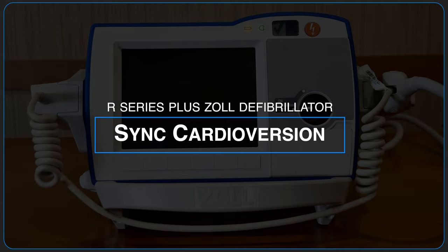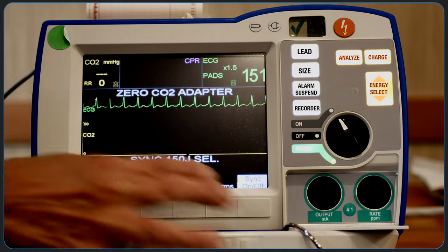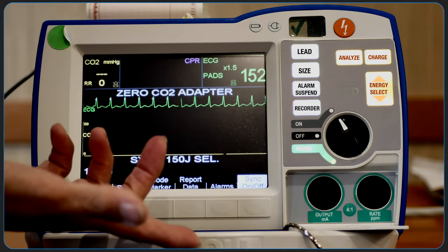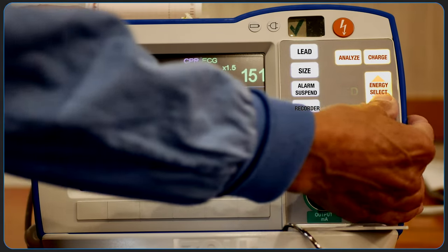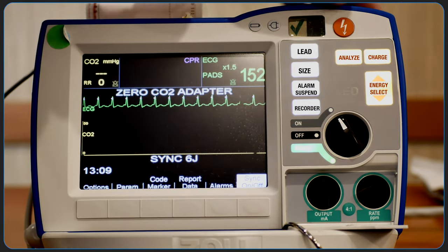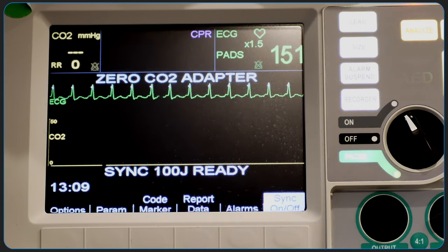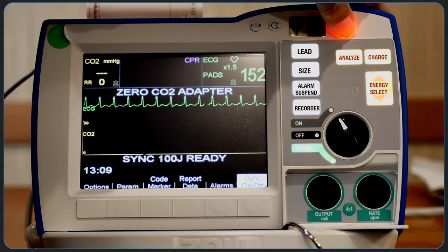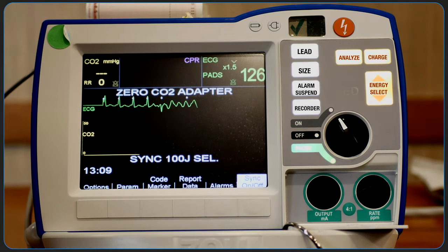To use synchronized cardioversion, press the sync on-off soft key. The selected energy level and sync will be displayed on the monitor. The energy delivered can be adjusted as indicated. Press the charge button to charge the defibrillator. Verify that the ECG waveform is stable and that sync markers appear over each R-wave. Now press and hold the illuminated shock button on the front panel. The defibrillator will discharge with the next detected R-wave.